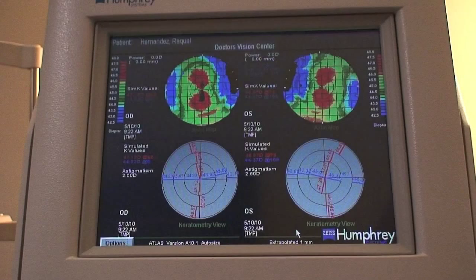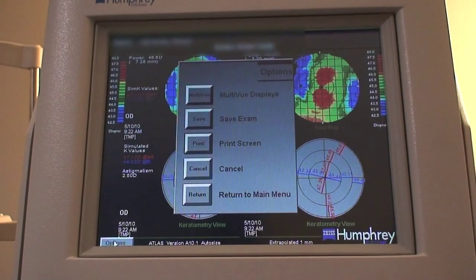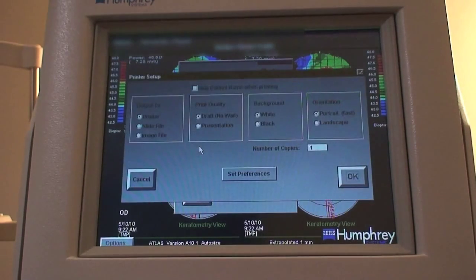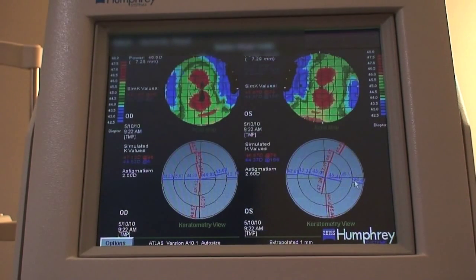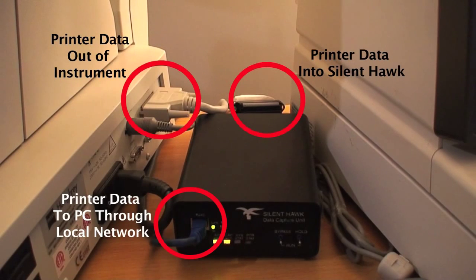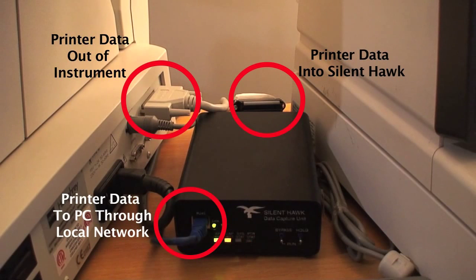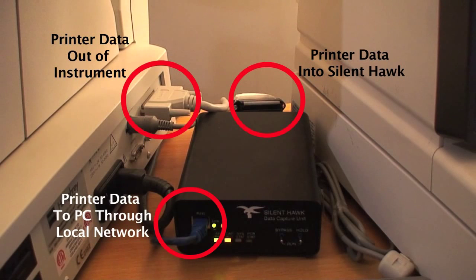We will start by demonstrating this with a Zeiss Atlas topographer. This Zeiss Atlas is running on a Windows 95 operating system. To use iPaperless, you simply pull up the instrument's report and click on Print. Our SilentHawk box, connected to the printer port of the instrument, then routes the printer data through the local network into a PC, where it is then digitized.